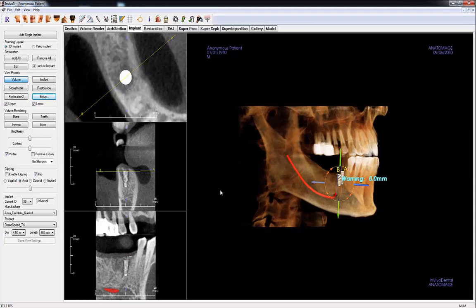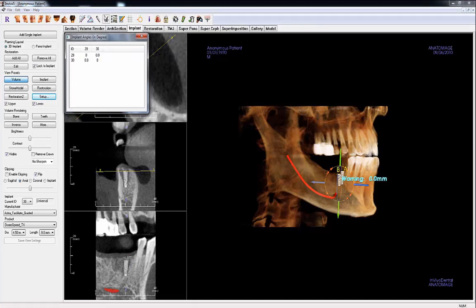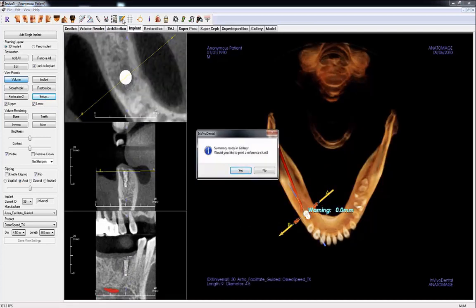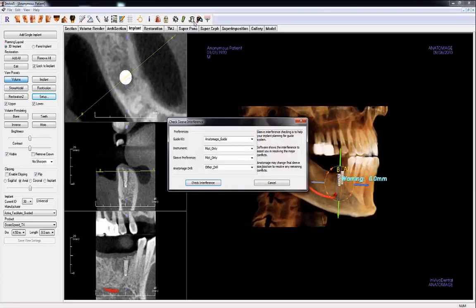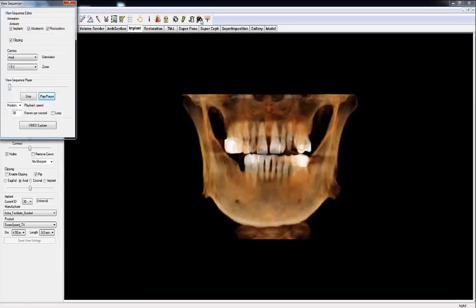In the toolbar, the Implant Angle dialog shows a summary of the angles between every implant. Create Summary captures an image of each implant with implant info in the Gallery tab, and offers to print a report of the implant's spatial positions and a list of implant information for reference and ordering purposes. Check Sleeve checks for any interference between the instrumentation, implants, and sleeves. View Sequence generates a preset video showing the placement of implants, abutments, or restorations that can be exported as a video file.